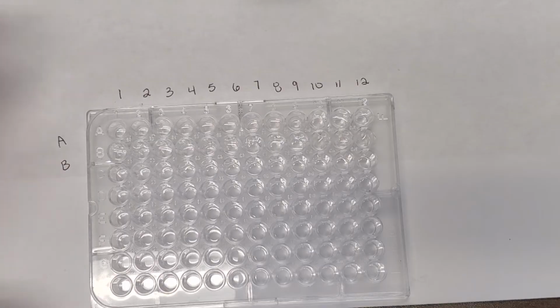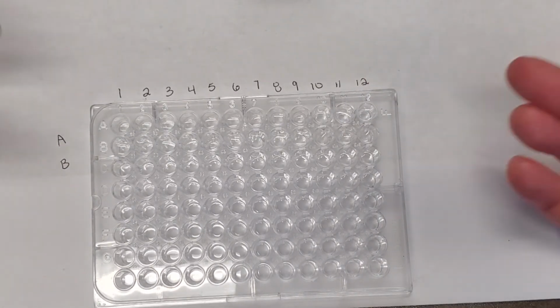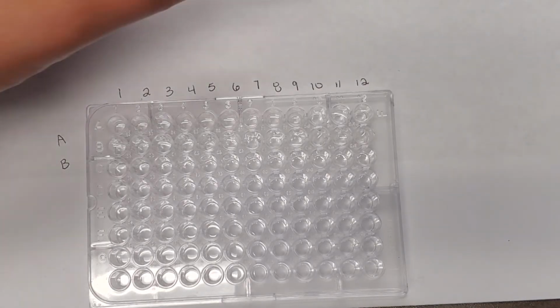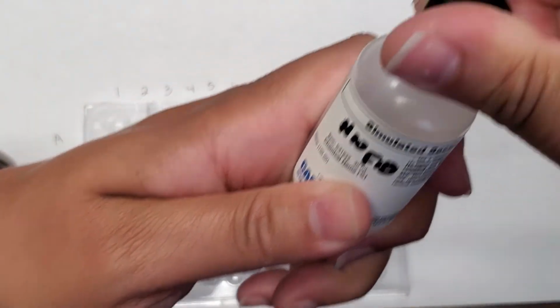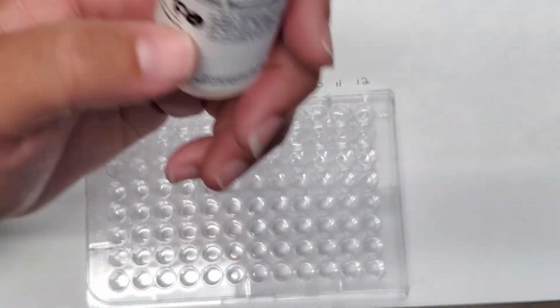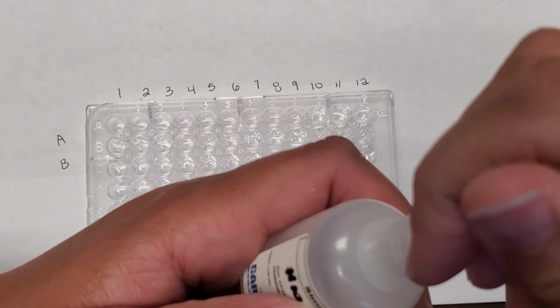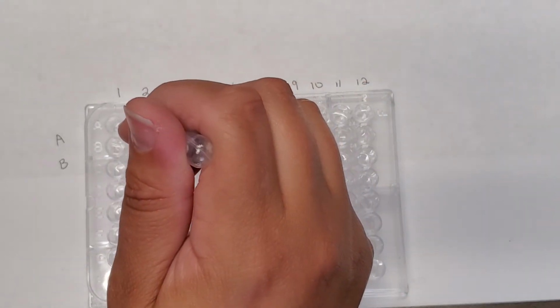Okay, so now what we have is that simulated antigen, we have the pathogen in there, we have the samples from our patients to determine whether they carry the antibodies or not. We're not going to be able to see that. So the first thing that we're going to add to all of the wells after we add that antigen and their serum is the secondary antibody. So once again, we're going to add 3 drops into each one of the wells.